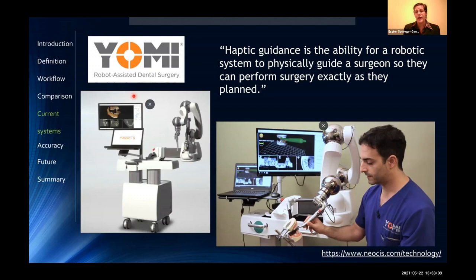I don't have very much experience with it, so I'm not sure how practical it is. It is a little bit more involved than having just virtual or static guidance, to my knowledge. If the person is gone and only the robot stays, that's a little bit different. But with the person, I'm not 100% sure what the major advantage of this system would be.